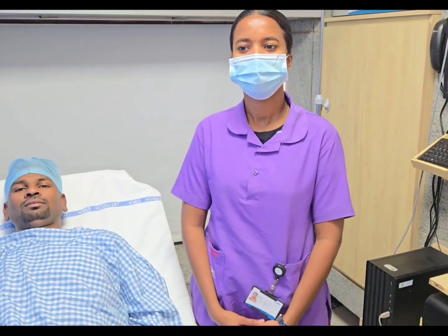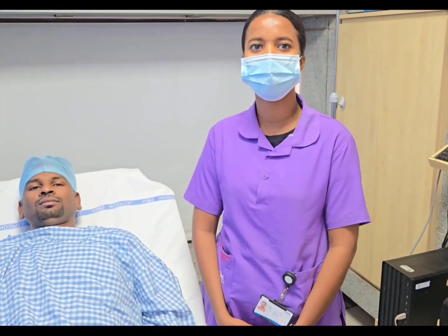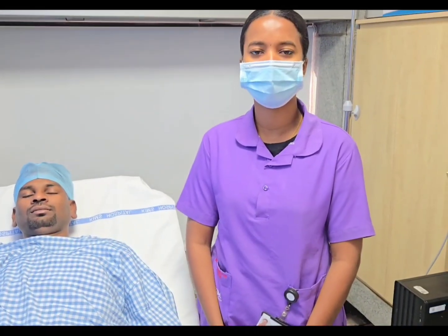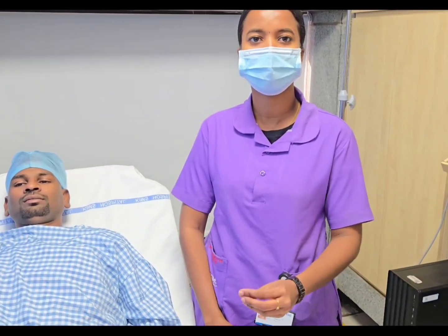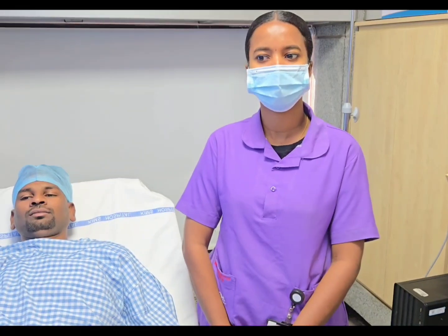Good afternoon everyone. Today we are discussing NPA and OPA. NPA means nasopharyngeal airway and OPA means oropharyngeal airway. Now I am discussing the NPA. What is an NPA? It is a flexible tube which is inserted through the nose to clear airway obstructions.